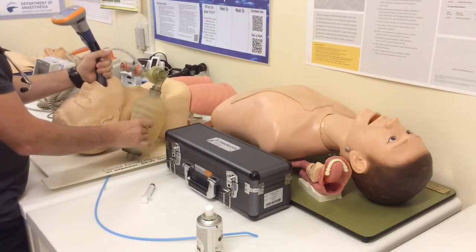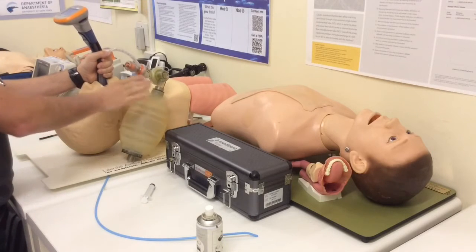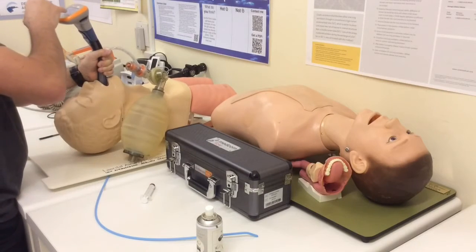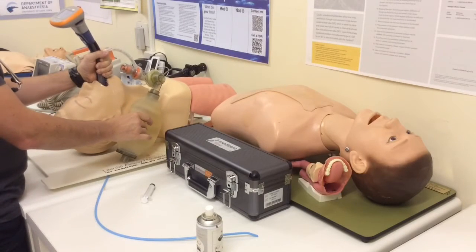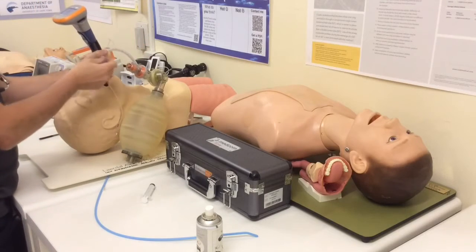In the operating theatre, or where I've got a ventilator pre-hospital, I actually connect the ventilator at this stage and let it ventilate all of its own accord, or I could be having someone else or an assistant doing it. Now on the screen, I'm able to manipulate the device, lift like I would for a laryngoscope, and obtain my ideal laryngoscopic view through the device. So what I'm seeing here nicely now, vocal cords, arytenoids, etc.